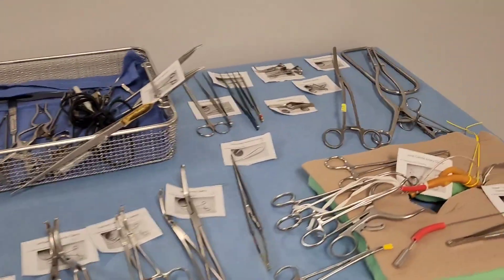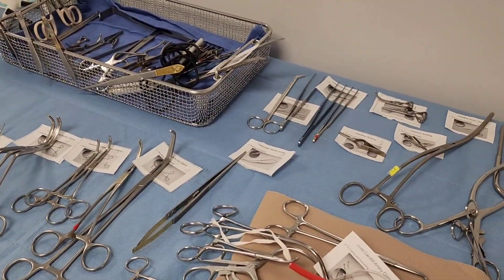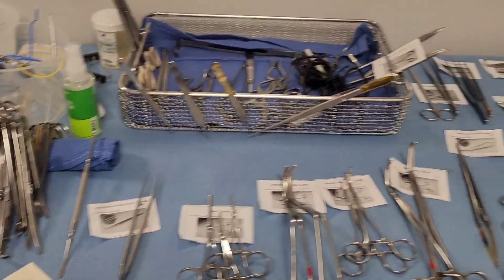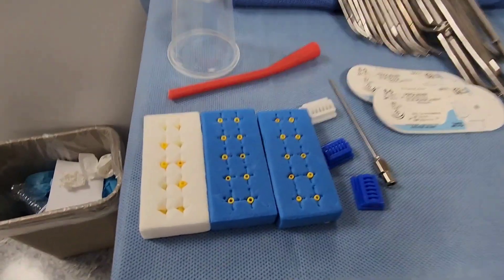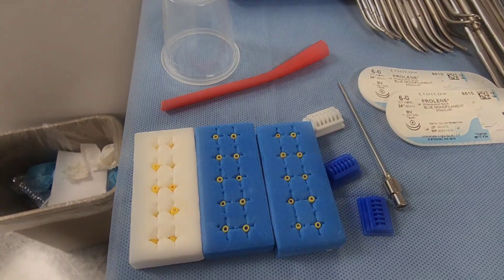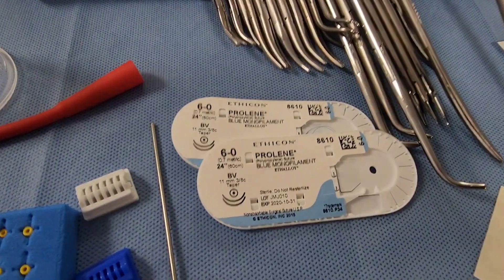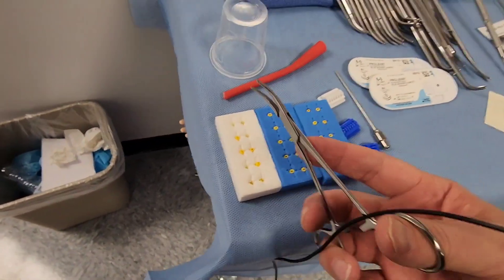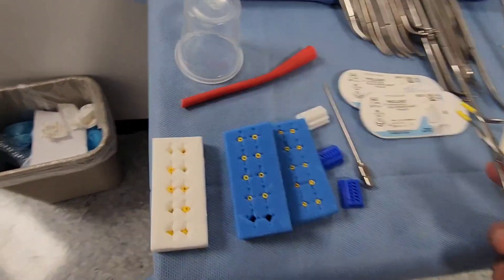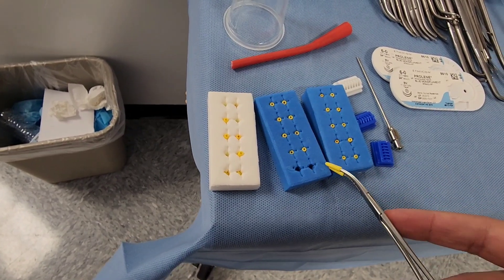Here we have basic stuff on our table for vascular. Peripheral vascular covers veins, arteries, percutaneous and cut-down procedures. First up are suture boots — these are accountable items used in vascular. They go on mosquito clamps to protect the suture thread. That's what they're designed for.